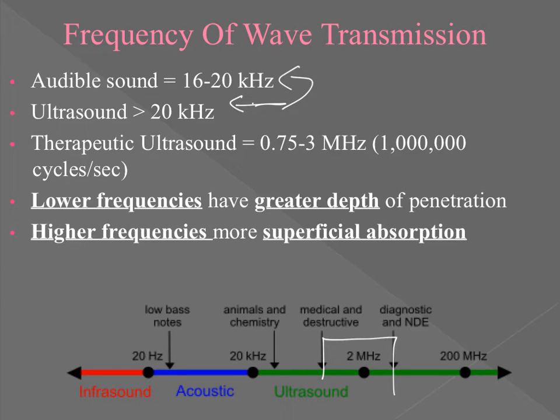And all of you are in the clinical setting now, hopefully, and all of you have probably at least done one ultrasound in your career. So when I'm saying lower frequency, I'm talking about that 1 megahertz treatment. And when I'm saying high frequency, I'm referring to that 3 megahertz treatment, right? So what we know about therapeutic ultrasound is this. Our lower frequency treatments, our 1 megahertz treatments, are capable of penetrating deeper than our higher frequency treatments, those 3 megahertz treatments. Our higher frequency treatments are going to be used more for superficial absorption, for targeting the superficial tissues.